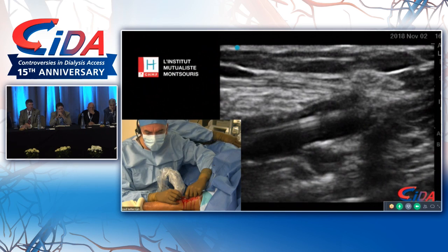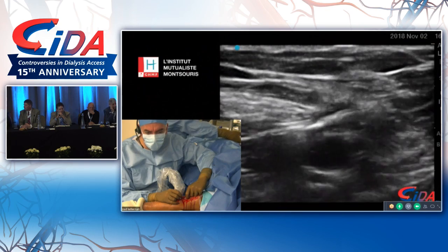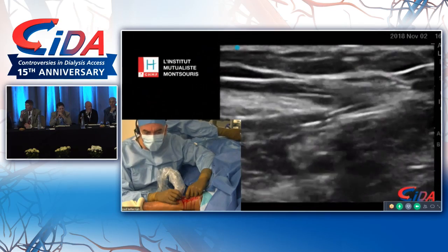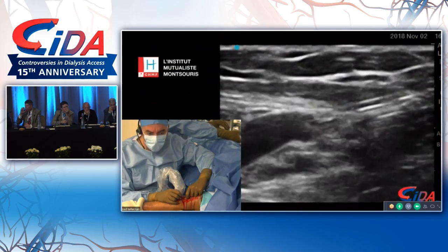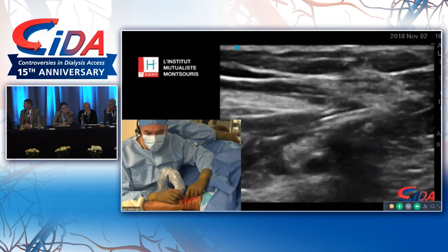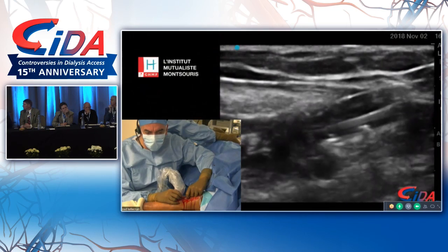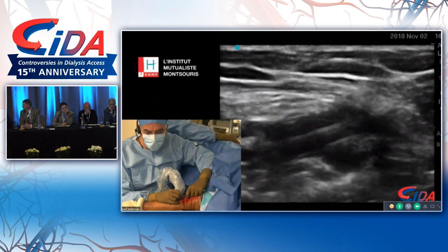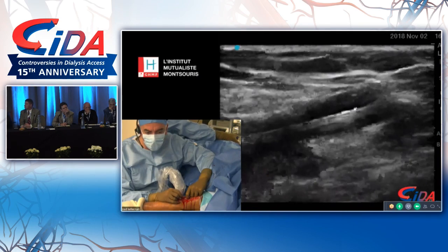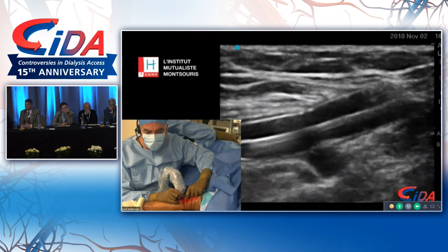Okay, deflate. What pressure are you applying? Nominal pressure, which is 8. This will give you a 5 millimeter, but sometimes, you know, we can go higher to get 0.5 millimeter more. The rupture pressure of this balloon is 13. How long do you hold the inflation? We're doing a few short inflations, and probably at the end of the procedure, we'll do a bit more prolonged one. So what I want to see is everything well dilated from the artery, the anastomosis to the perforator.